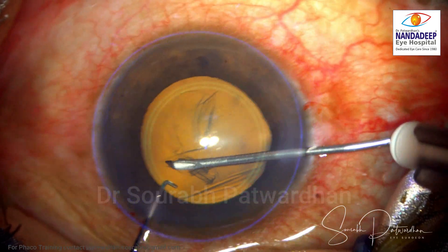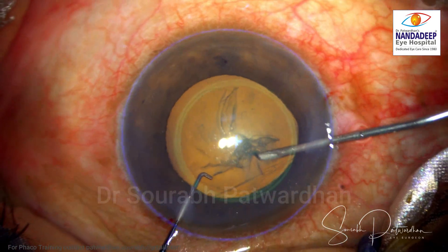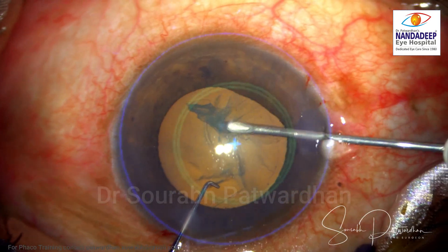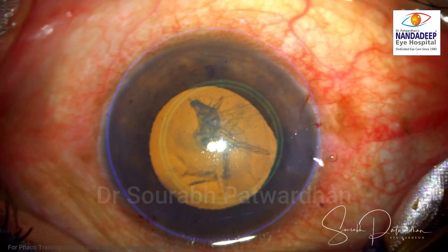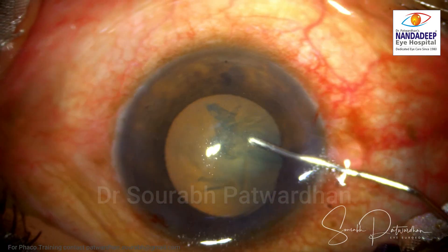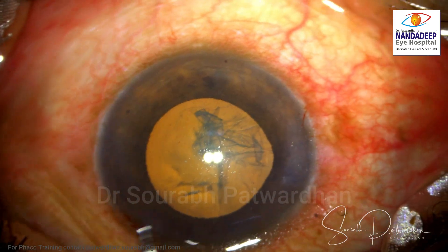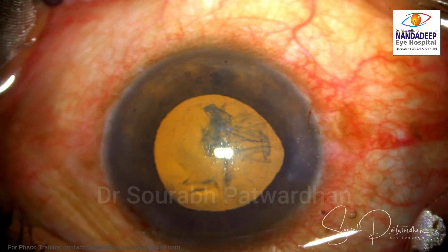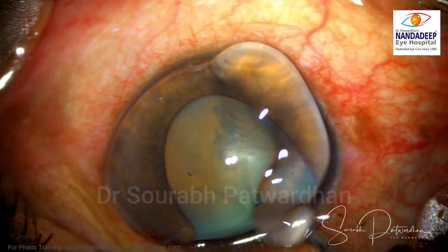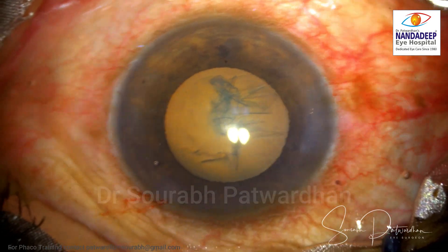I am doing capsulorhexis here using the Callisto Eye, which is a markerless system, and I am trying to target the CCC or the visual axis. As you can see, because of the very shallowness of the anterior chamber, when I was planning to do hydrodissection, I knew that if I push fluid, the iris was trying to come out of the main incision. So I decided to go ahead without any hydrodissection here and do hydrodissection later.